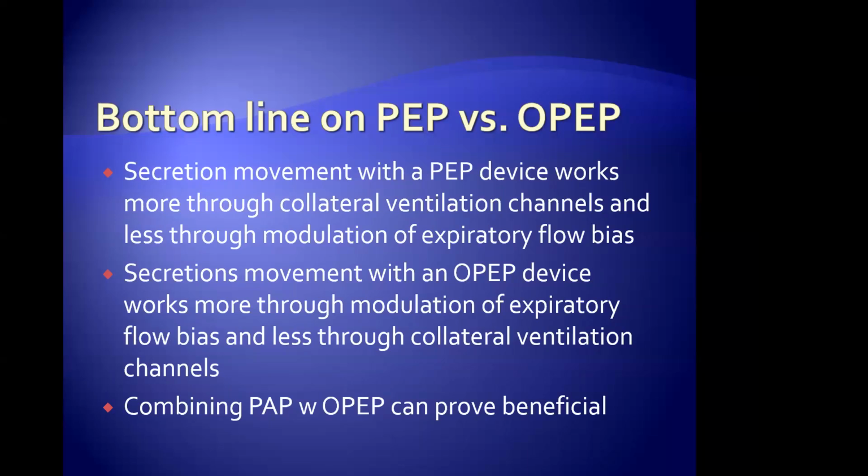Combining those two. How many of you do that? Right now, how many of you combine PAP therapy with OPEP devices? So here I have my OPEP device. Then I have a PAP device that I can tie in to my OPEP device. Remember, we talked about that a few slides ago. Now I got a Venturi device. Is that a PAP device?